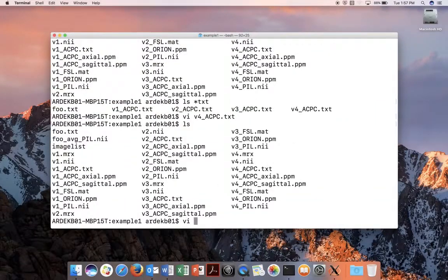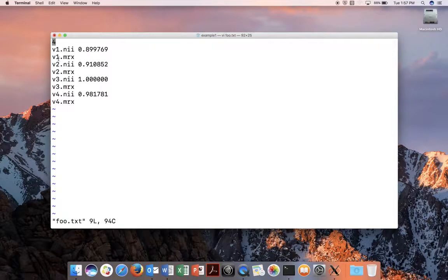And the other file, named your output prefix.text, is a file where the first line is the number of images, the second line is image 1 followed by a scale factor, and the third line is the registration matrix for image 1, and then the following lines pertain to image 2, and so on.